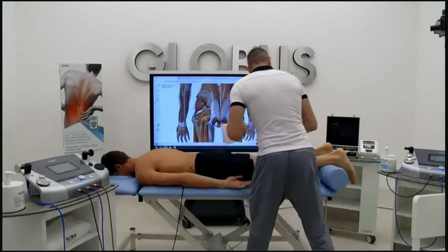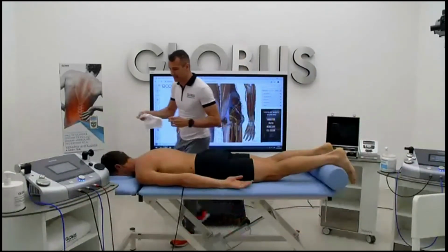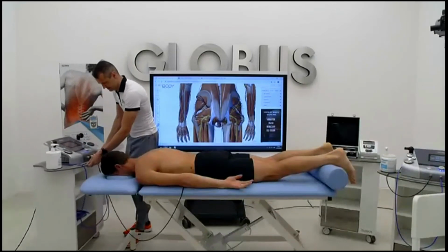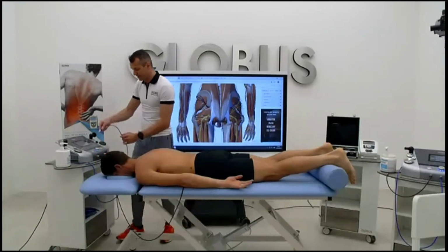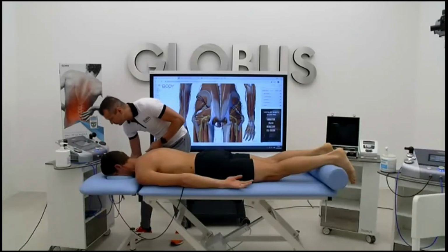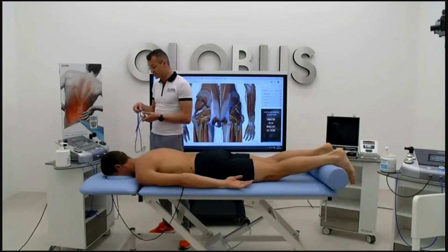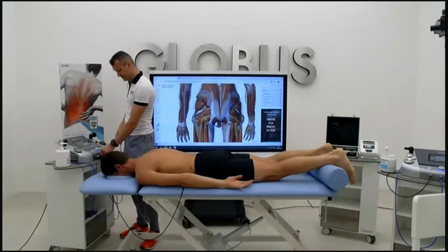Questa qua. This is a live session, guys, so let me organize. What we need to do is, first of all, to change the cable. We need to put the cable for the fascia tools, the same that we use for the hands-free treatment. So the blue one, that is resistive, as you know.